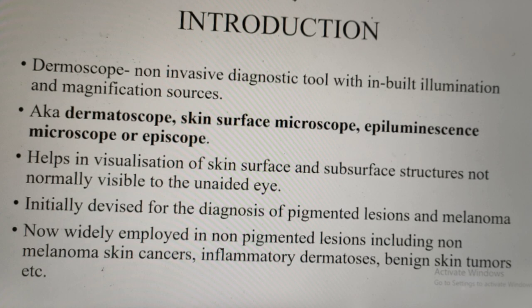Initially, it was devised for the diagnosis of pigmented lesions and melanoma, but now it is widely employed in non-pigmented lesions including non-melanoma skin cancers, inflammatory dermatosis, benign skin tumors, etc.